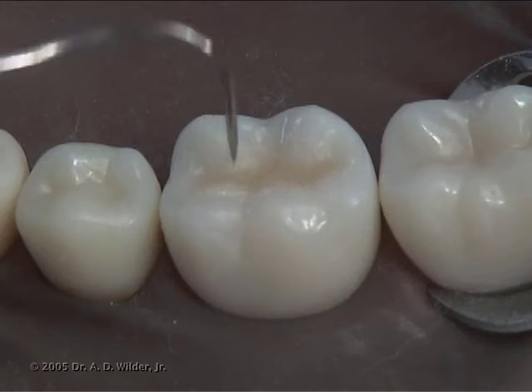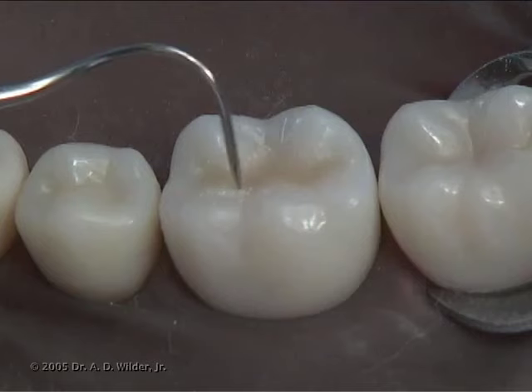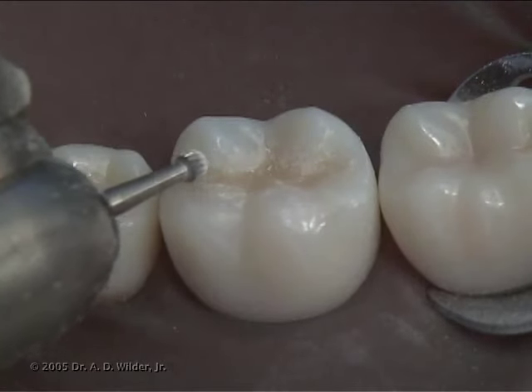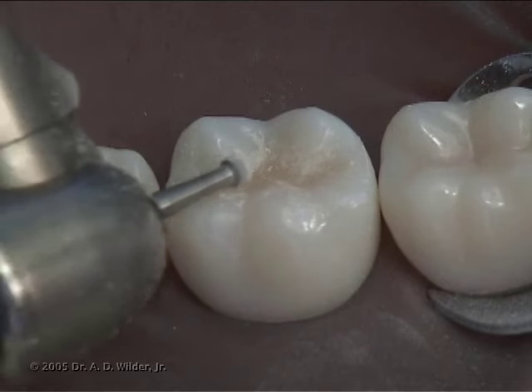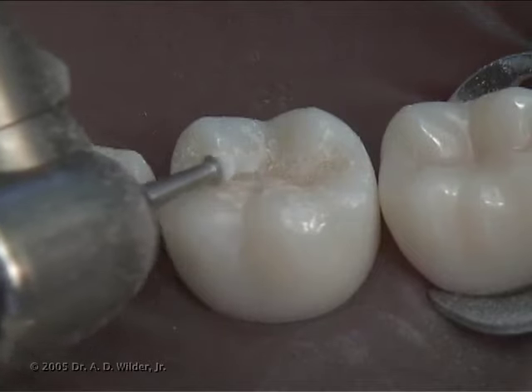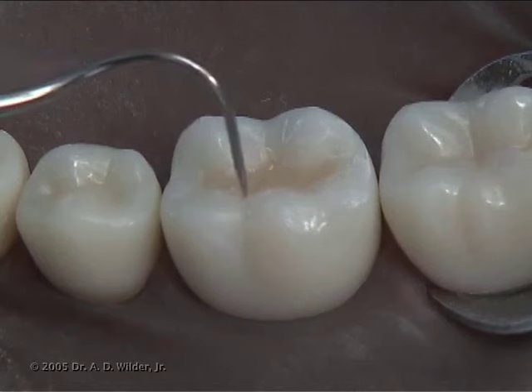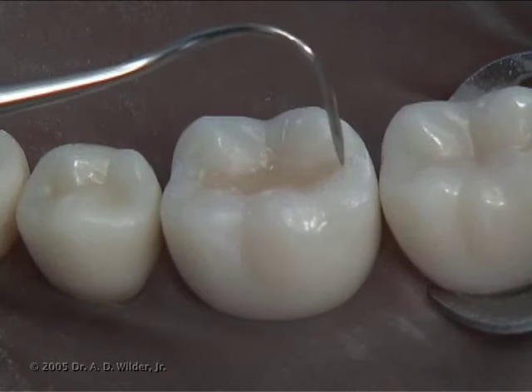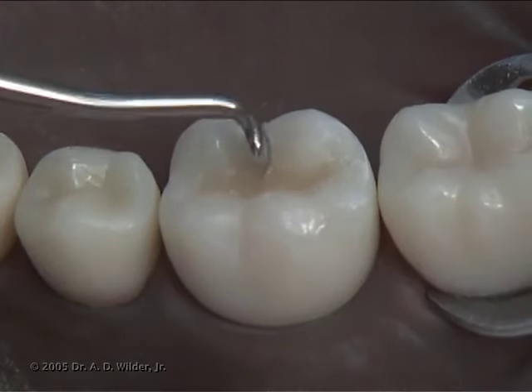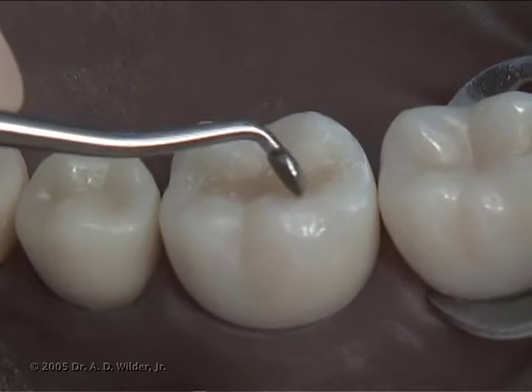Check with an explorer from tooth to restorative material to look for any presence of flash or composite material that snuck up and onto the unprepared enamel surface. If the explorer catches anywhere, you can remove this flash with the finishing burr. You can also remove flash manually with a cleoid discoid hand instrument used along the cavosurface margin.